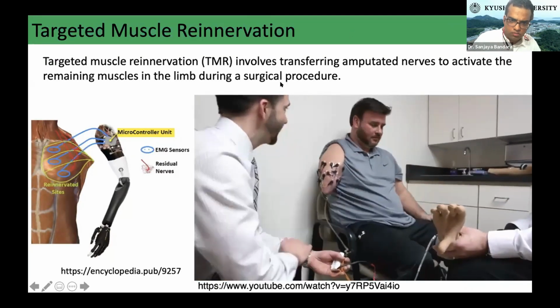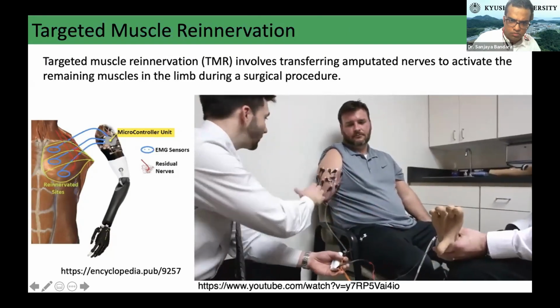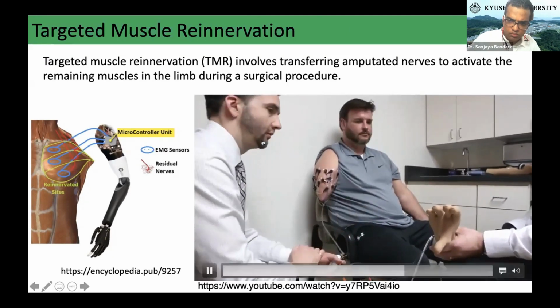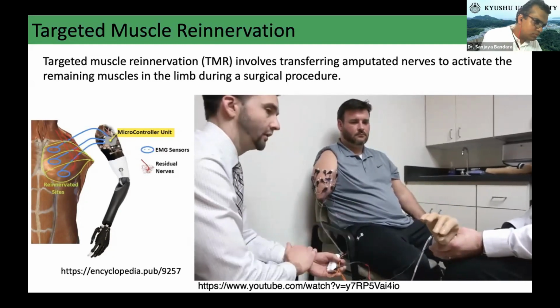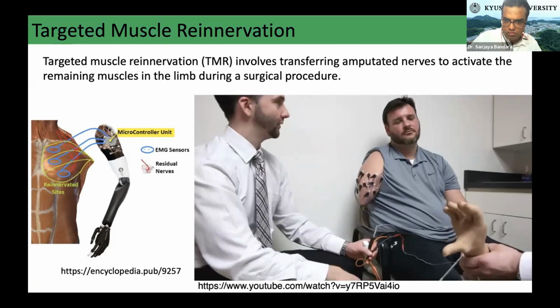I'm just tensing it up. I can feel it just. That's okay. Now try this for me. I know we didn't train the system doing it lighter, but I want you to try that. Close it just a little bit lighter, not squeeze it too hard. Okay. There you go. And open a little bit lighter. Great.